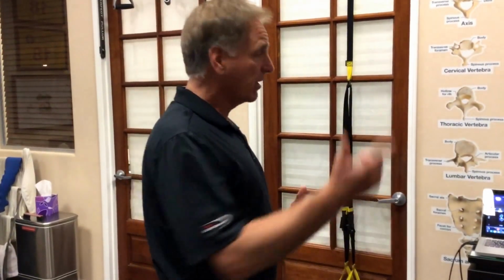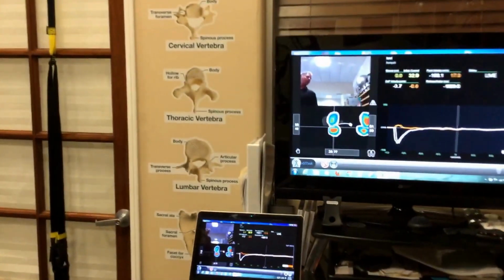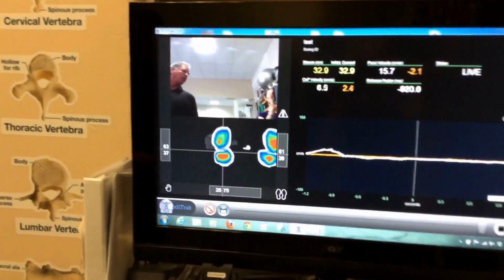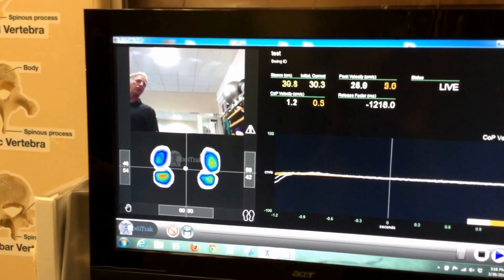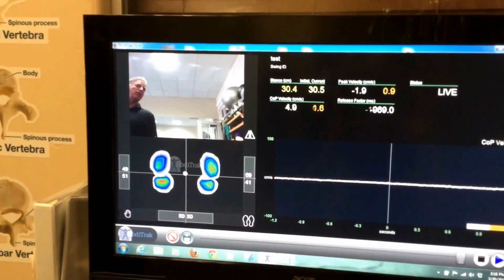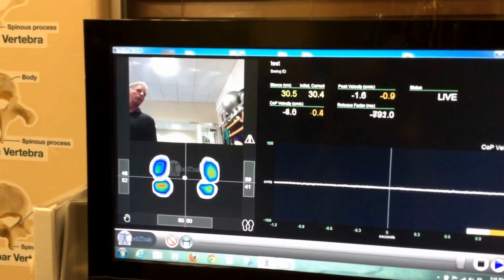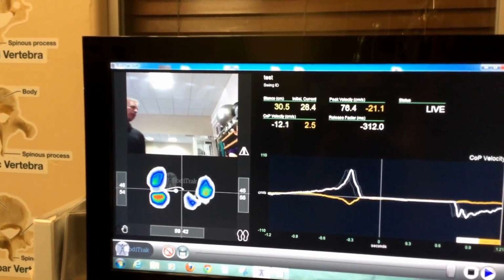From here we go right into teaching the biofeedback. We're going to teach a patient how to feel the centeredness and how to bring themselves into a tall spine position. And when they get in a tall spine position, we can get them right to 50-50 just like that, in most cases. If I can't within 2 or 3 minutes, I know I've got a lot of work to do. So this is your first Boditrak tip for use in the clinic, and I hope it can be very useful as it has been for me. Thanks.